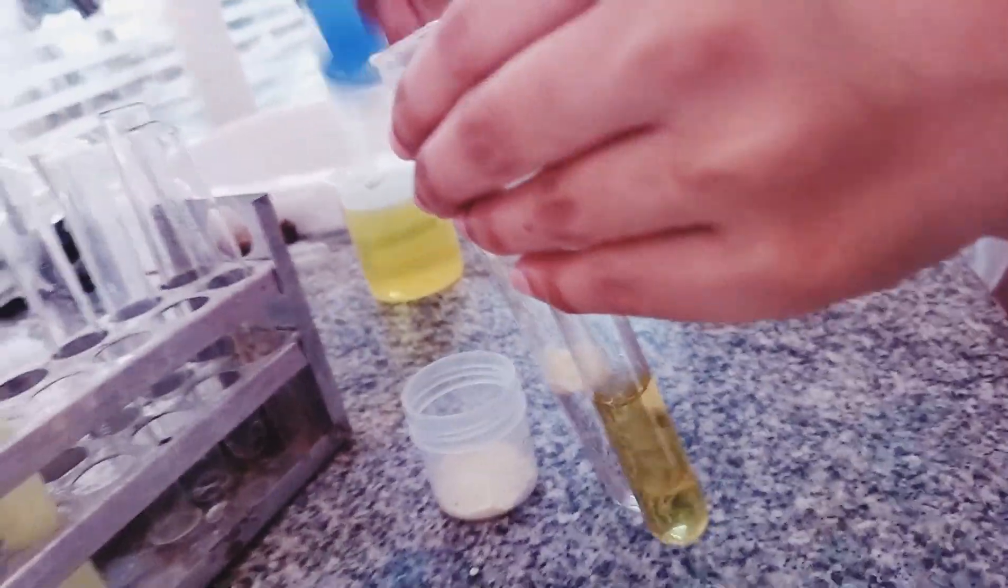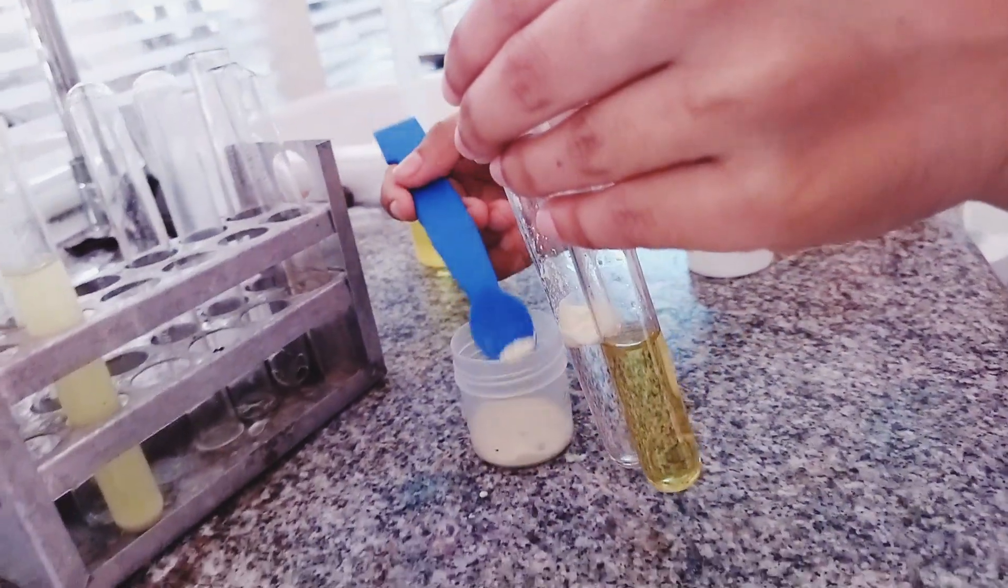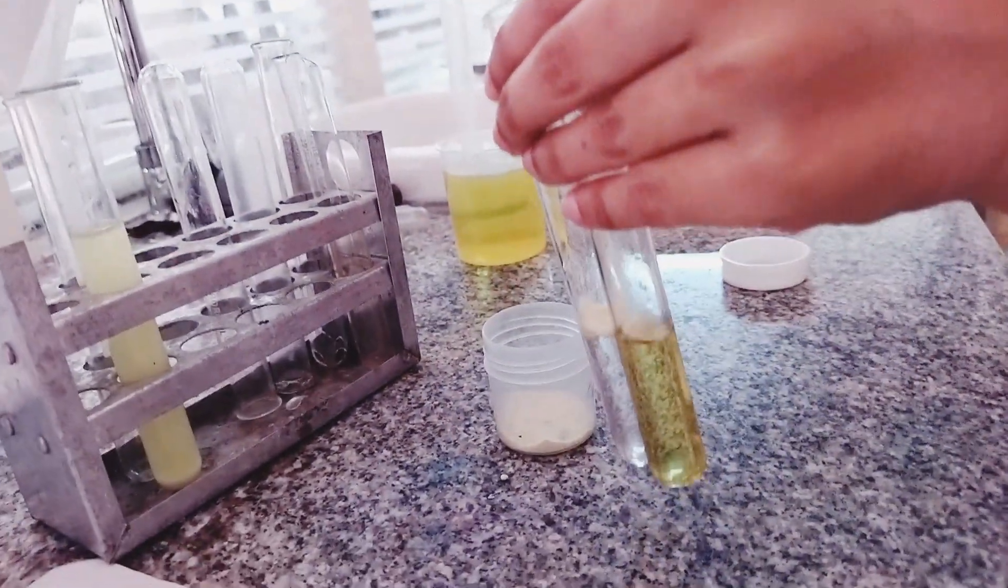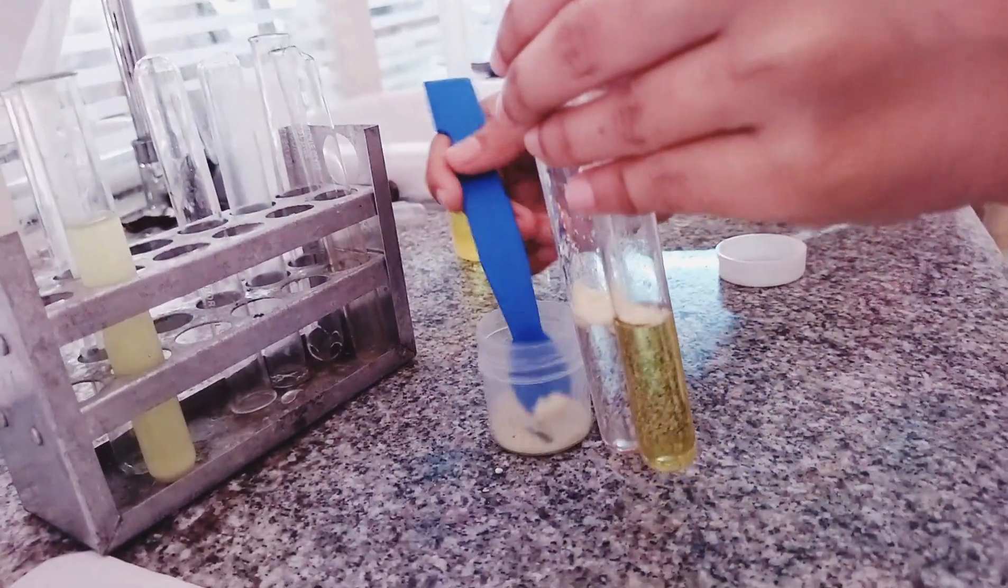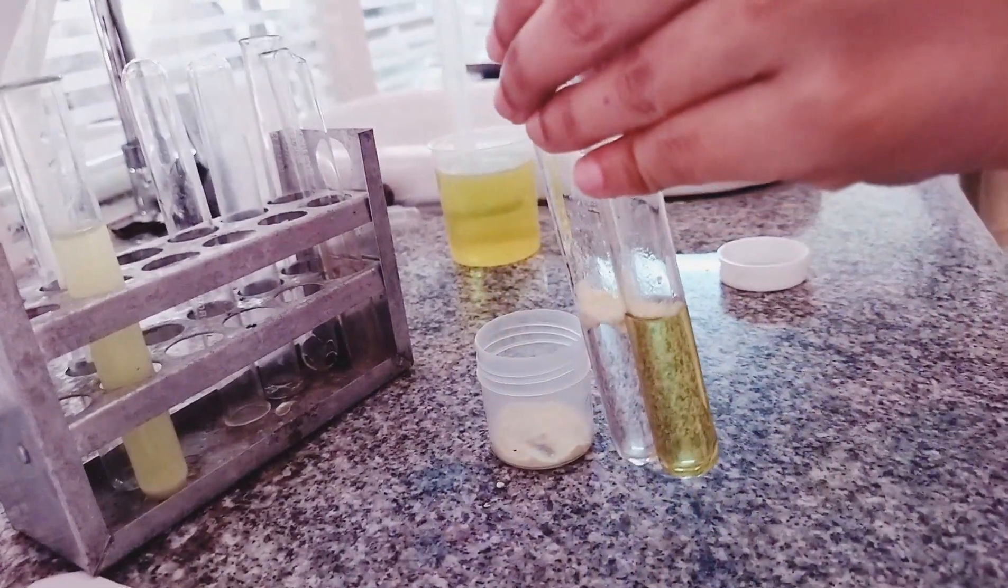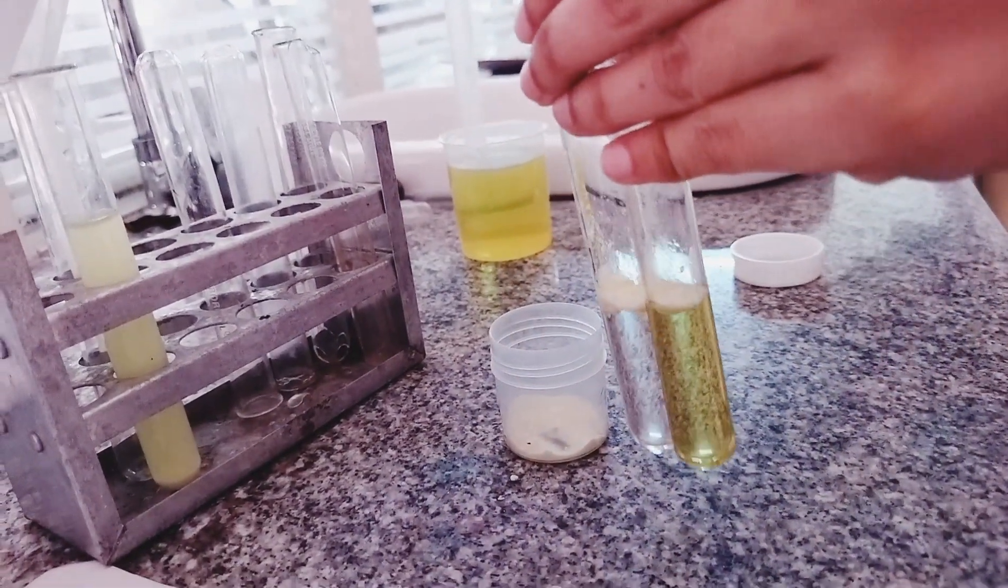So, sprinkle the Sulphur powder in both test tubes, that is T and C.